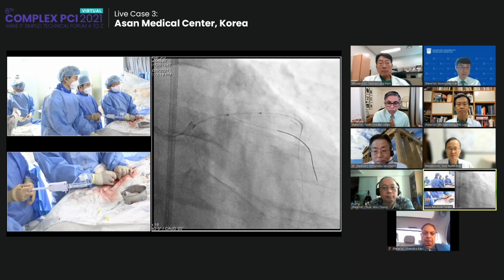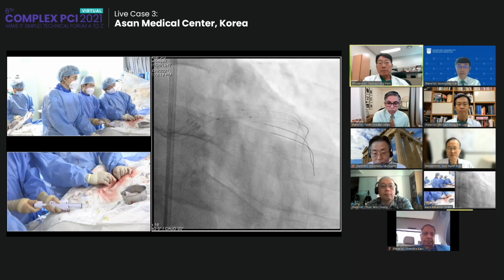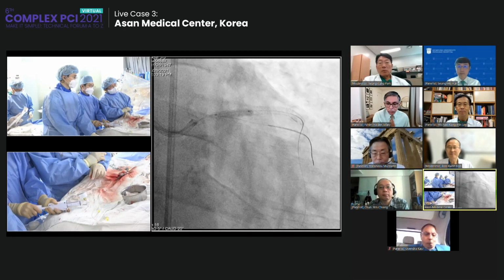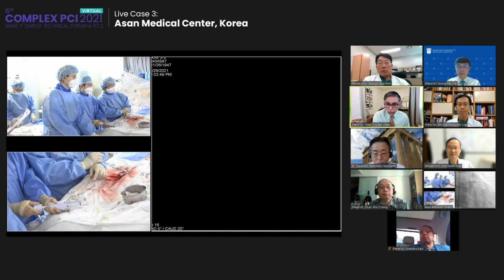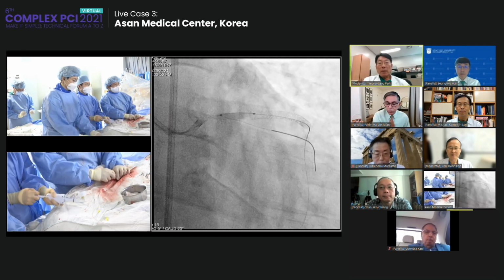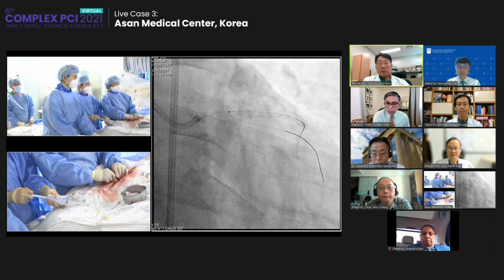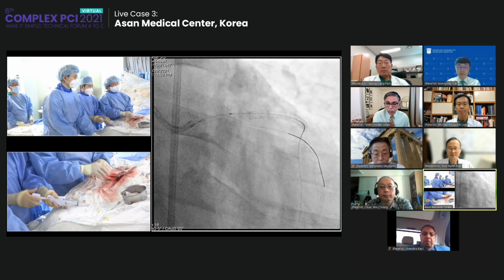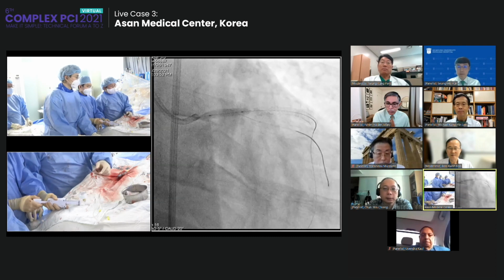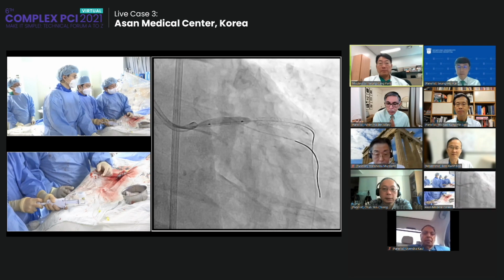This is a 3.5 balloon. 10, 12, 14, 18, 20. It works. 3.6, right? Yes. The indentations disappear. Deflation. 3.5 works. 14, 16, 18, 20, 24. All right, big one. Deflation.